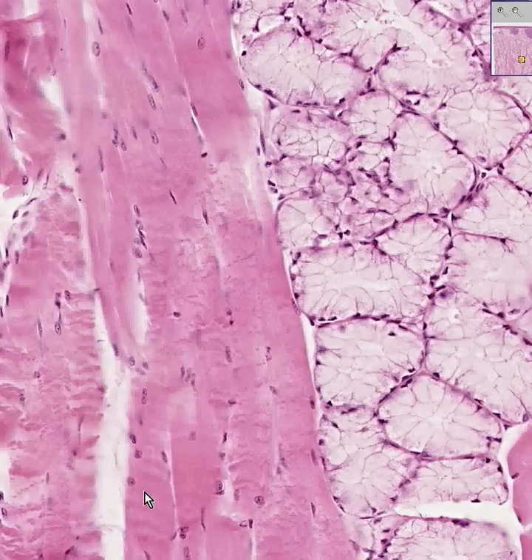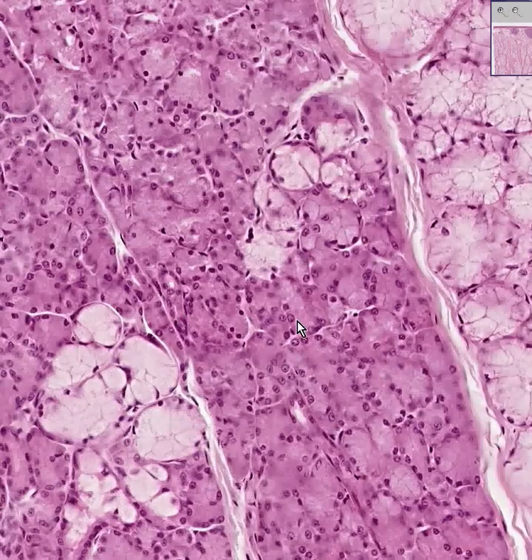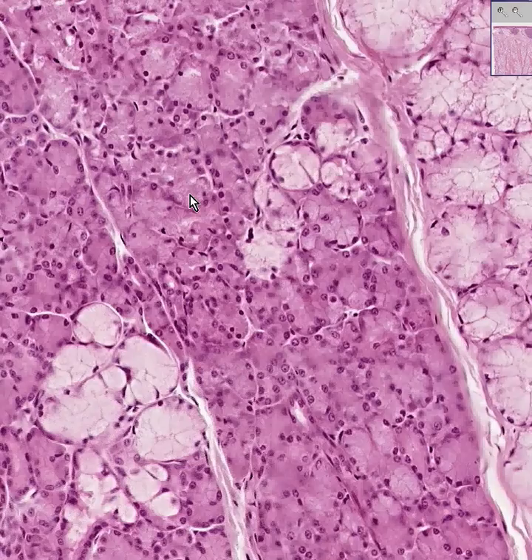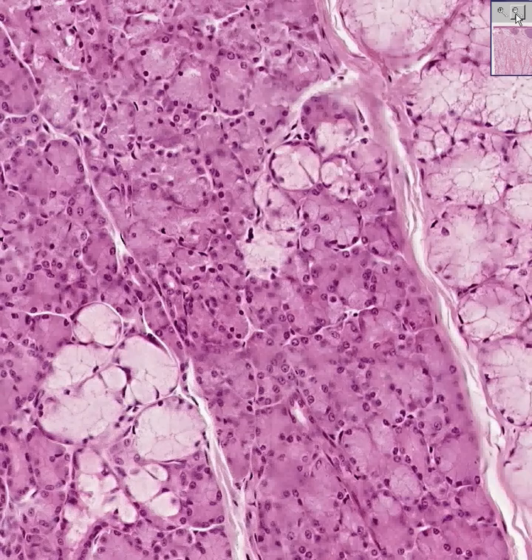These are all striations — dark, light, dark, light — and these are all glands. You can see their cytoplasm is clear and foamy and mucinous with the nucleus at the base, so these are mucinous glands. We can also see some other glands intermingled in which the nuclei are rounder, less complex, not so close to the base, and have a pinker cytoplasmic staining rather than whiter — so these are the serous glands, the accessory salivary glands of the tongue which secrete serous material, whereas the majority secrete mucin.